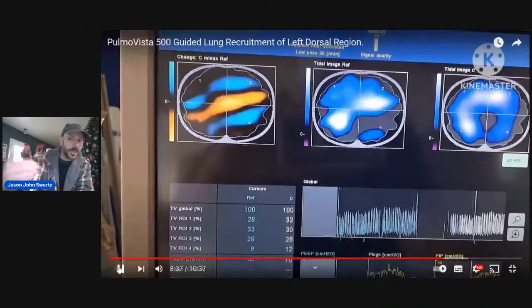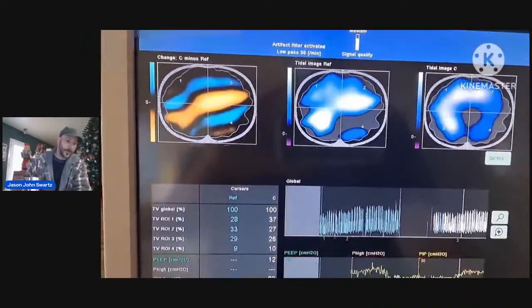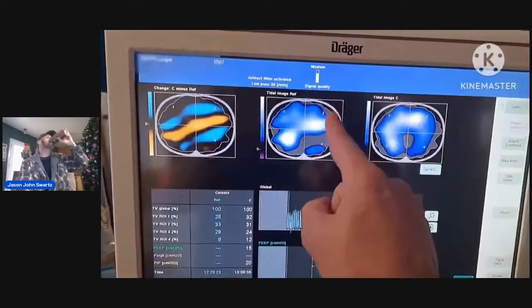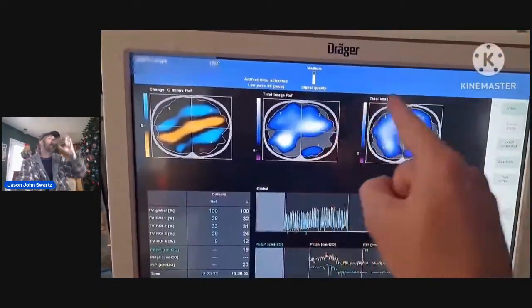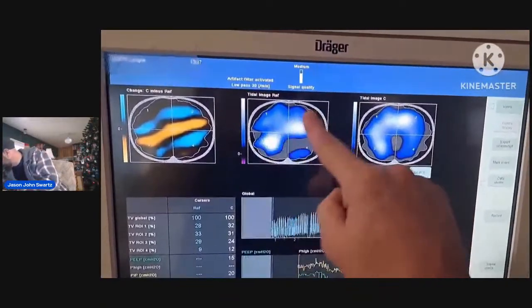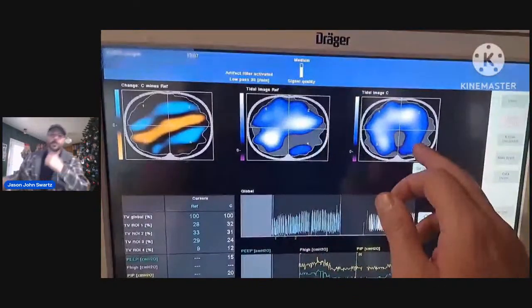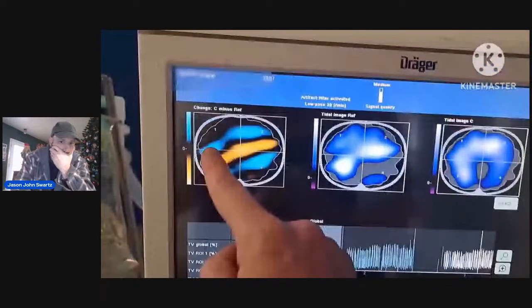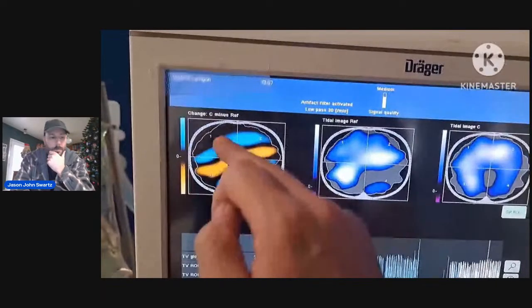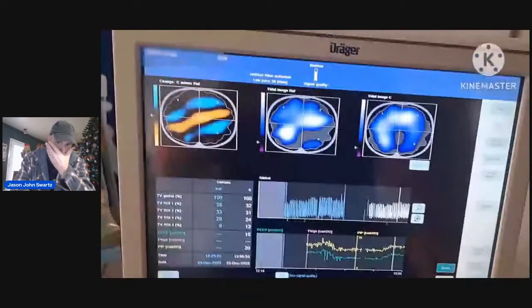It's so much information you can pull from each panel. See, it's nicely opened up. Any questions? And the color code is saying that compared to here, when you're comparing this to that, you notice there's less white, there's less distribution here because it's been open there. So everything smooths out. So it's saying that air in the reference that was here has been redistributed up here and down here, making a more homogeneous ventilation. Okay.